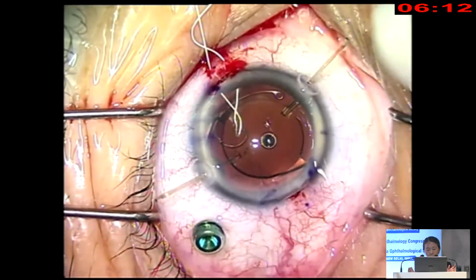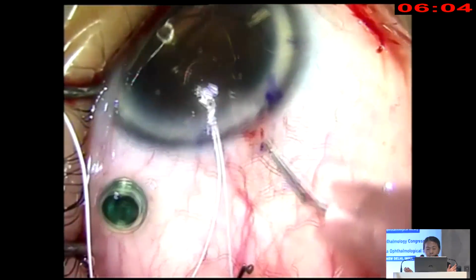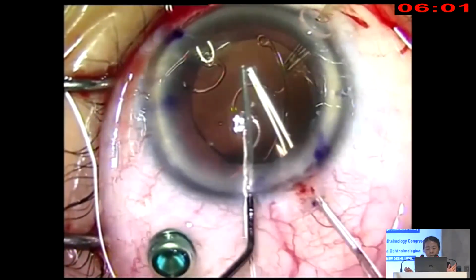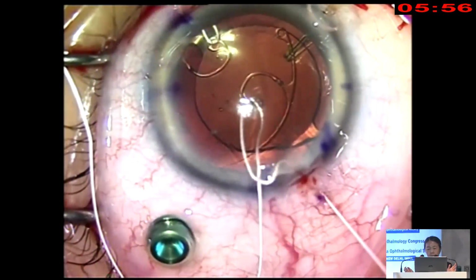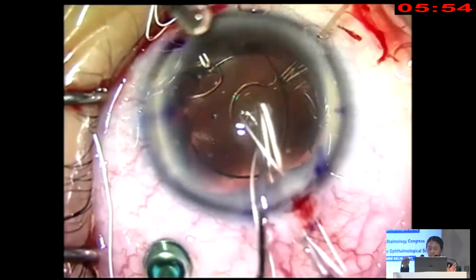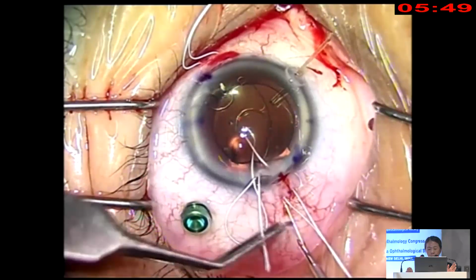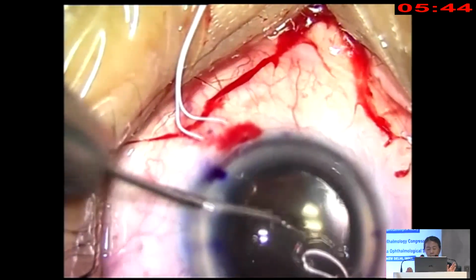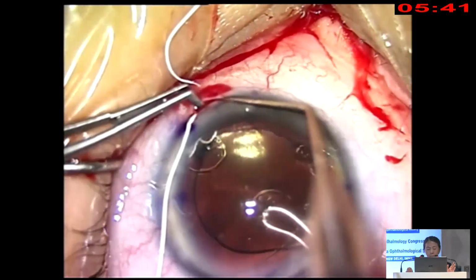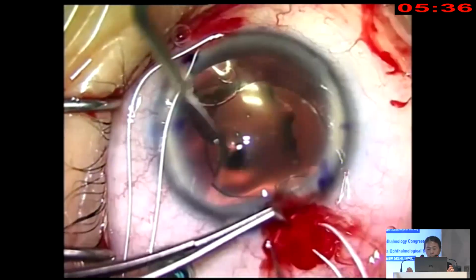And then this is what you've seen in already the previous video. Insert the CTS. I leave a hook there so that I can actually easily slide the CTS into the bag. You can see me entering the angle because I do not want to hit the anterior capsule when I come in. Okay, so I first enter and then I change the direction. So that's the lasso, which I explained earlier. Leave a little bit of slack. Okay, you can now position your instrument, your devices. All right, this is retrieving the sutures from the Hoffman pocket.